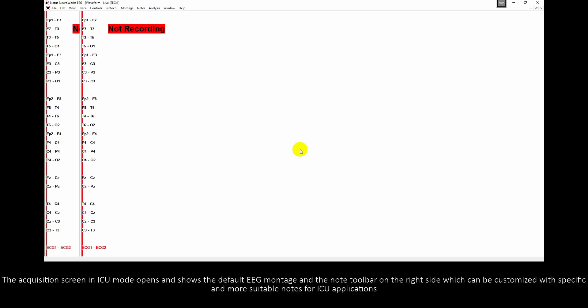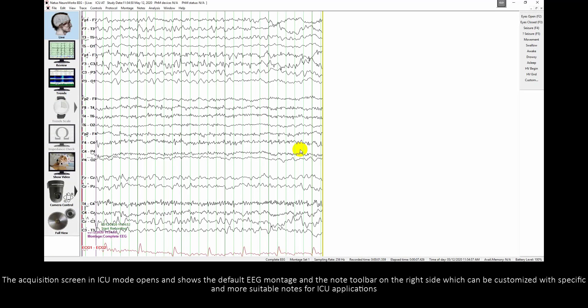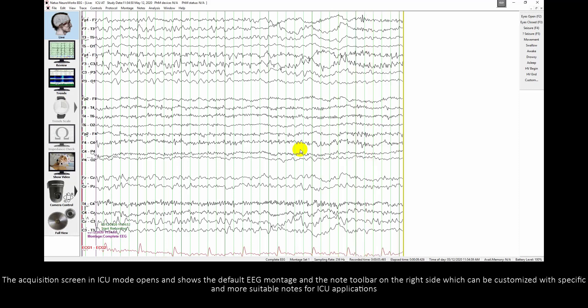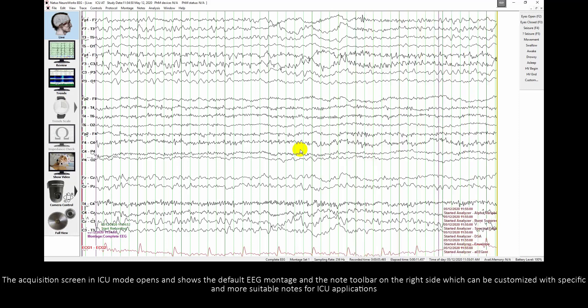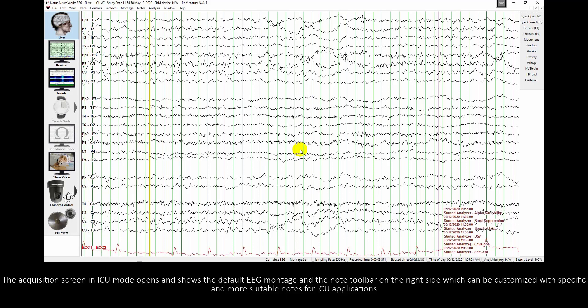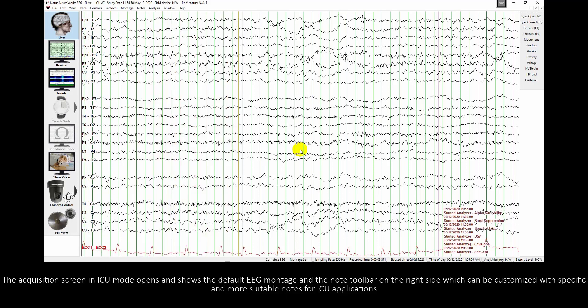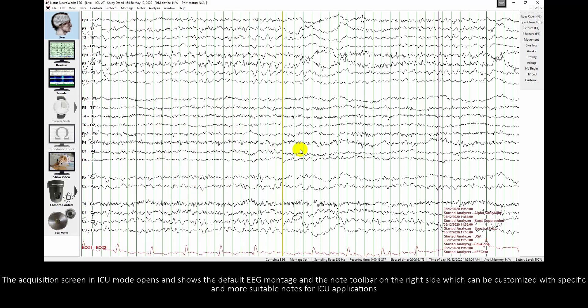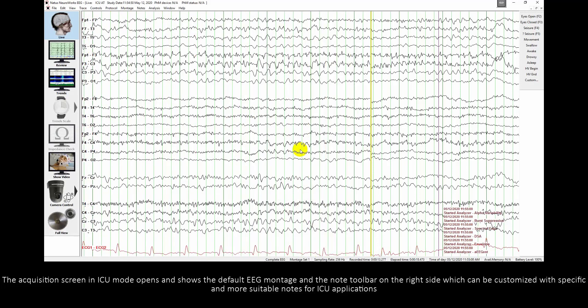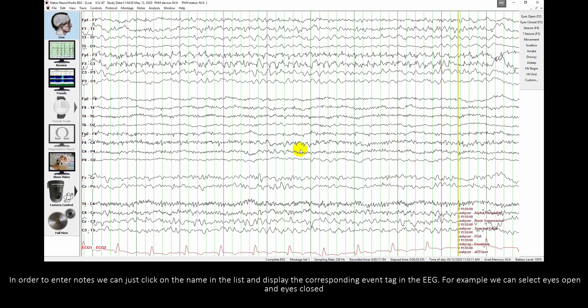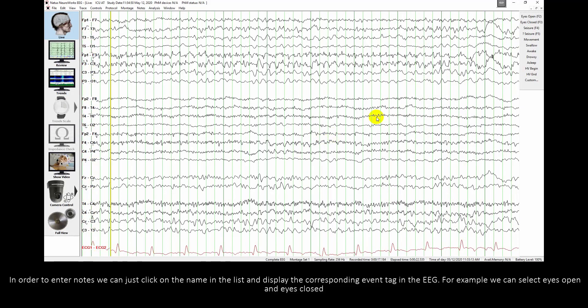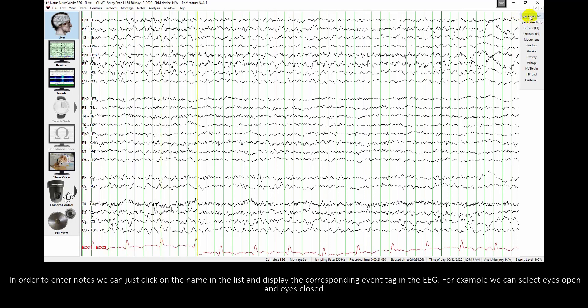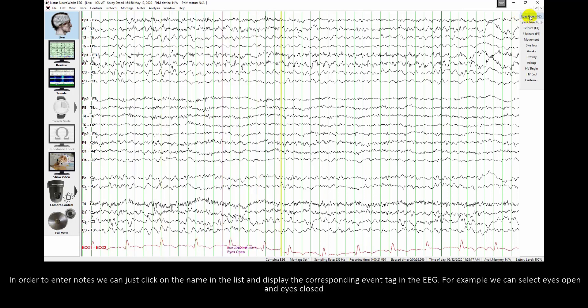The Acquisition Screen in ICU Mode opens and shows the default EEG Montage and the Note toolbar on the right side, which can be customized with specific notes more suitable for ICU applications. In order to enter notes, we can just click on the name in the list and display the corresponding event tag in the EEG. For example, we can select Eyes Open and Eyes Closed.